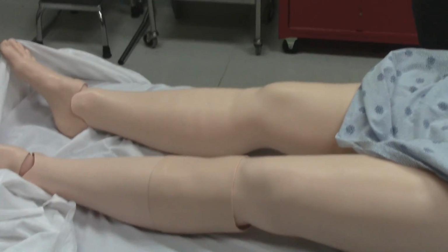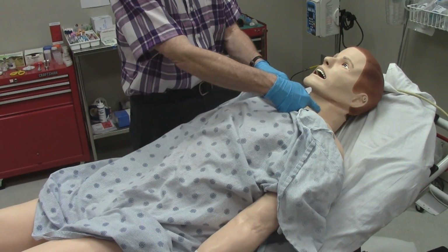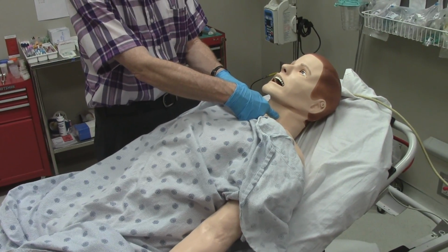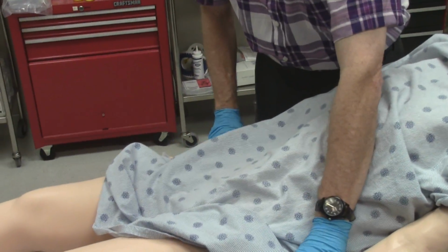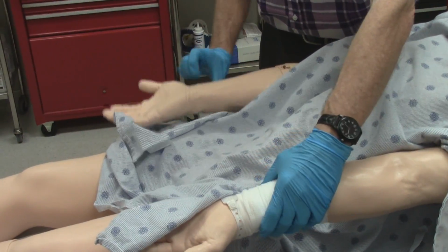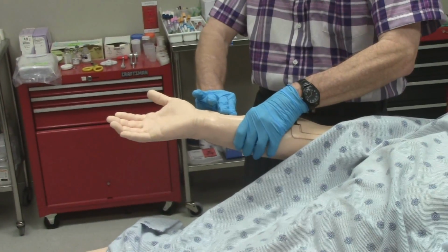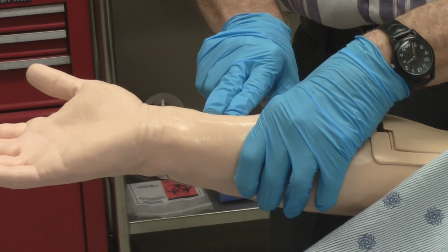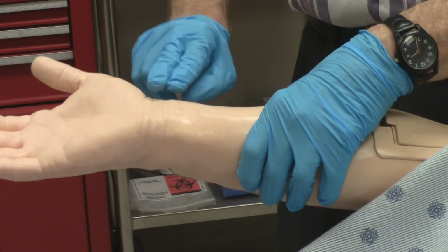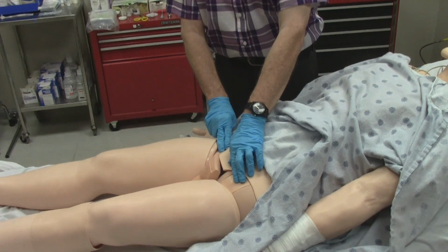Moving back up to the top of the patient, we'll talk a little bit about pulses. The patient has bilateral carotid pulses. There are bilateral radial pulses on these mannequins. One thing to know about them, though, is they are a little bit higher than a typical radial pulse. I'm feeling the pulse right now, so it's a bit higher than you might actually normally palpate for a radial pulse. There are bilateral femoral pulses.